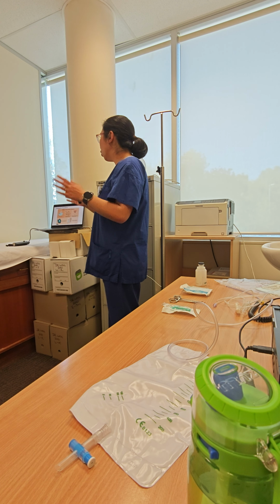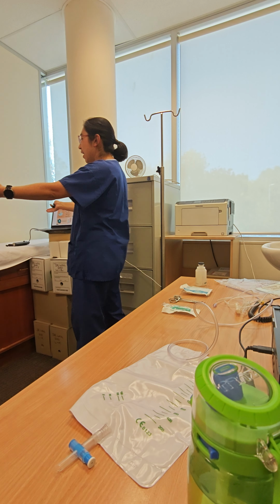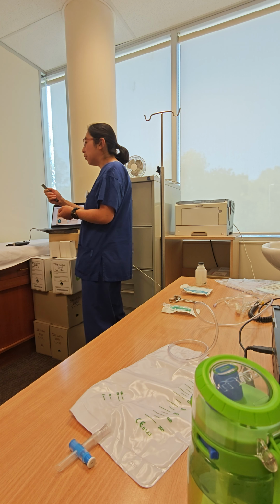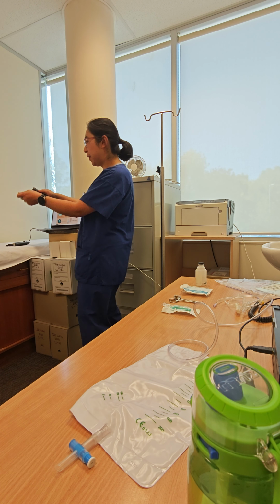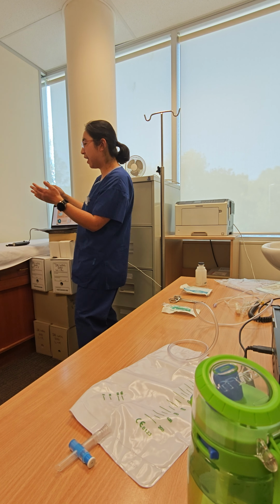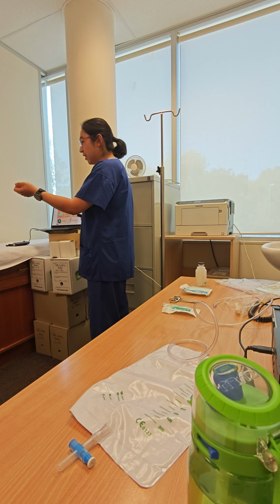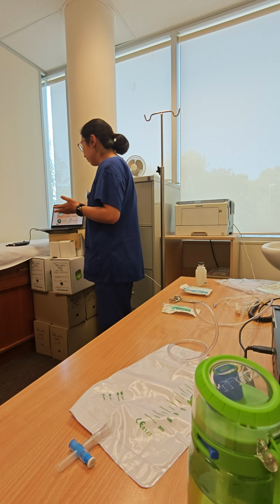Now the normal cystogram procedure is very simple. We put the patient on the bed, supine, and the radiologist puts the catheter into the urethra, into the bladder. We give contrast, the radiologist takes pictures at whatever angles they like, and when they're happy, they're done. Then we remove the catheter and send the patient away.